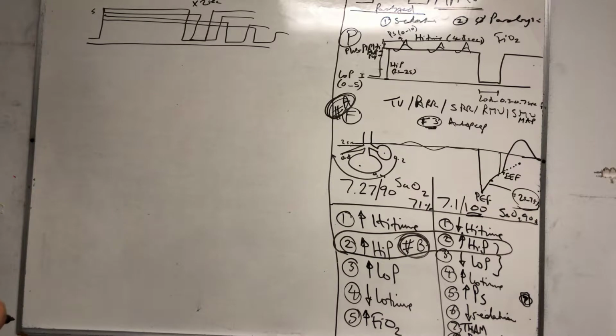How many times do you do it every day? Nobody knows. I do it every 12 hours here. But I'm worried that having a rigid protocol might cause the same problem that SIMV had. The way SIMV died is that people had a rigid protocol every 6 hours, and patients were ready to be extubated, but then you're doing a protocol.